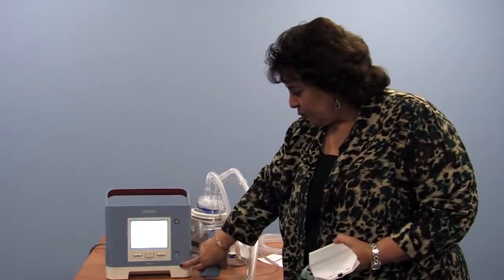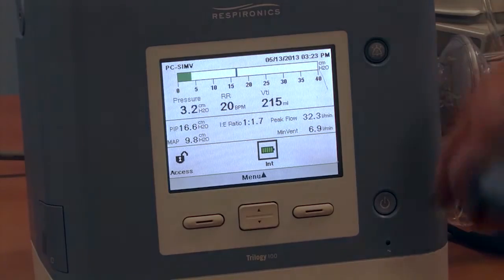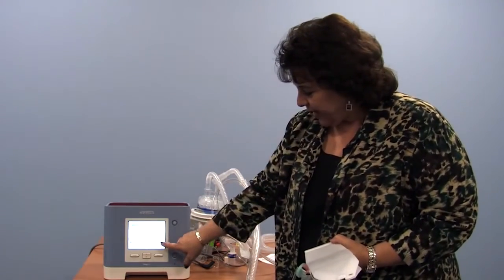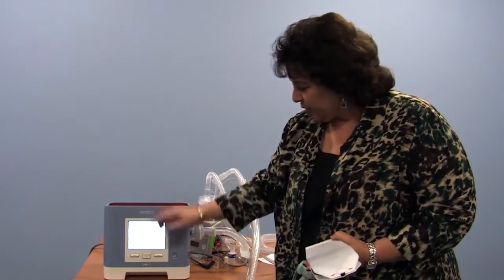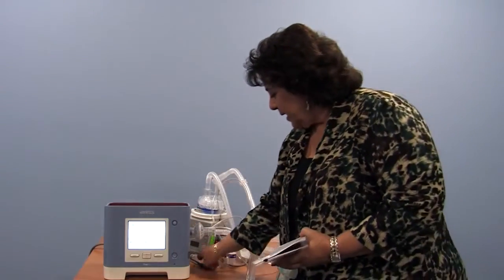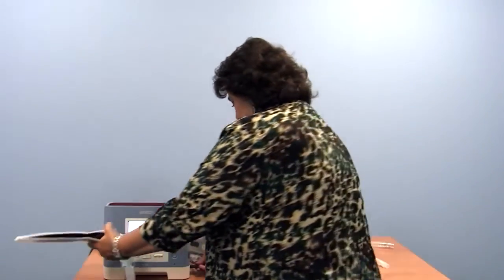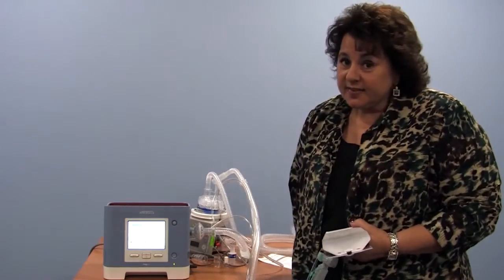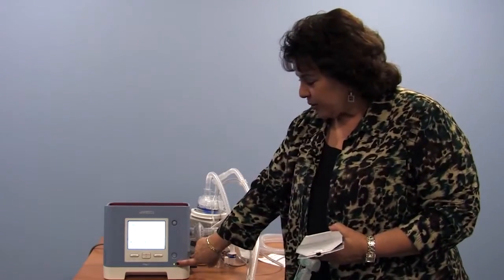You can safely assume when you see this light lit that you are on external power. Now we see that we have both batteries, the 3-hour, internal and external, detachable, connected. And now we'll put the power back on. The green light shows us that we're on external power. Now this doesn't know whether you have a generator to your home, but we know we're on external power, and it's up to you to know how long that external power may last.